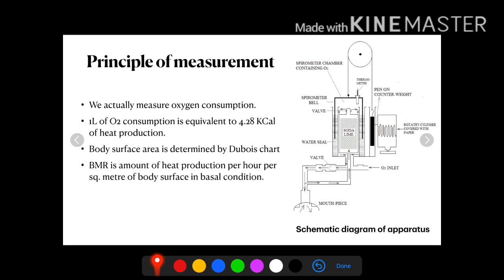The recording will be complete in six minutes. After six minutes, the paper will be taken out and the rise of the curve should be measured. There is another equation: one millimeter rise corresponds to a specific amount of oxygen consumption.